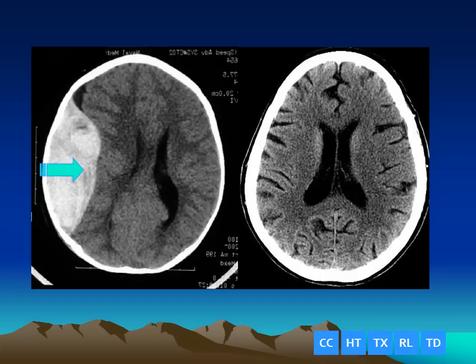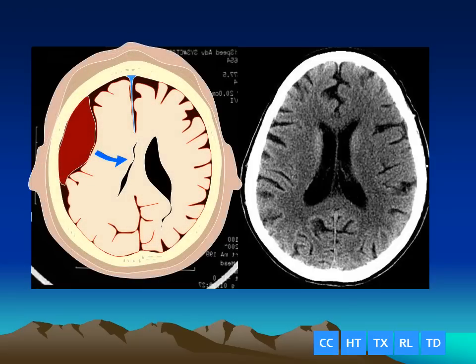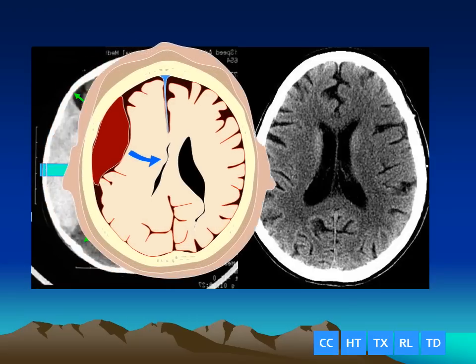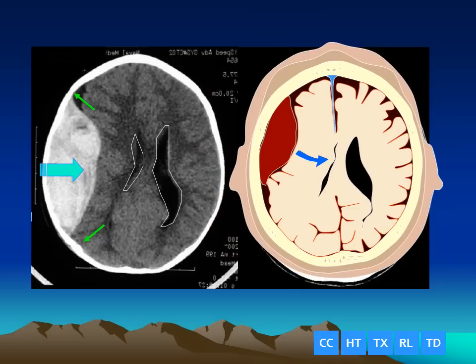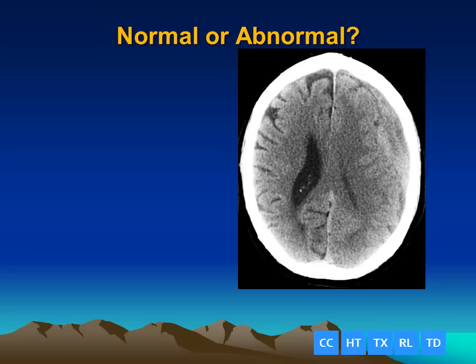Here is another abnormal lesion at the level of the lateral ventricles. We can see a large hyperattenuating extraaxial lesion limited by the coronal and lambdoidal sutures, typical for an epidural hematoma. The ventricles are being compressed and displaced by this extraaxial mass lesion. We have a biconvex extraaxial hematoma consistent with an epidural hematoma.